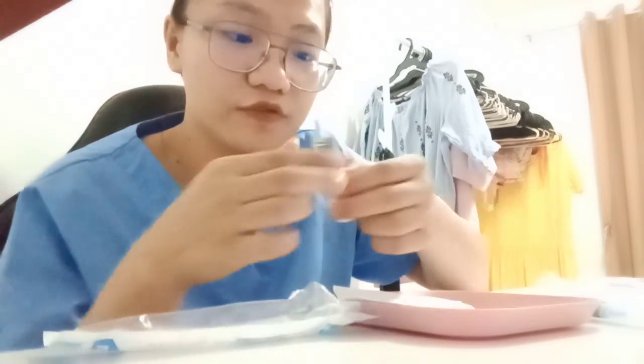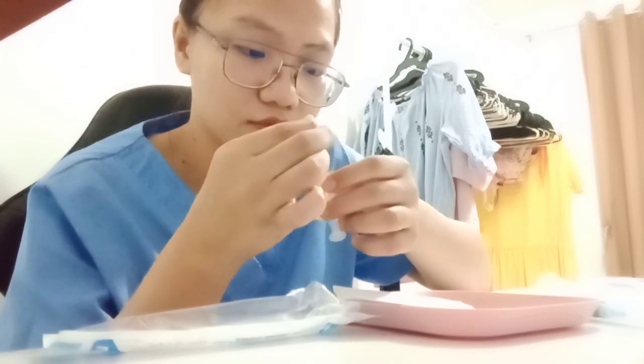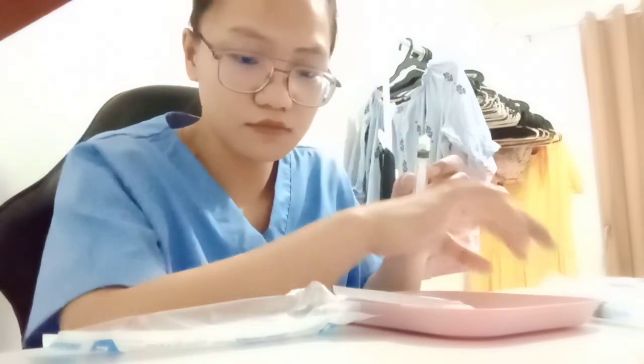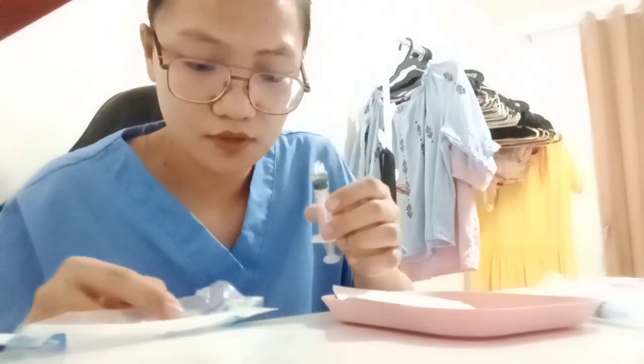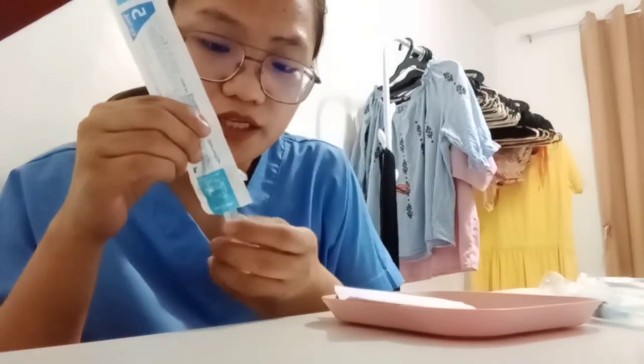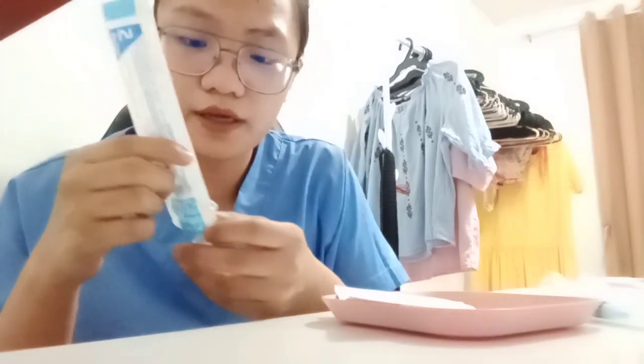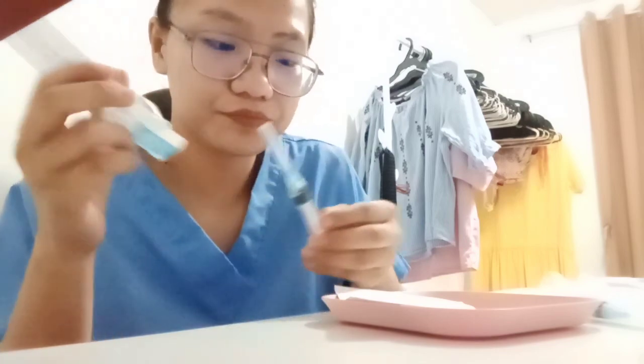First is to remove it. Be careful not to touch the needle because it should remain sterile. And that's it. That's the 1 cc for vial ampicillin.